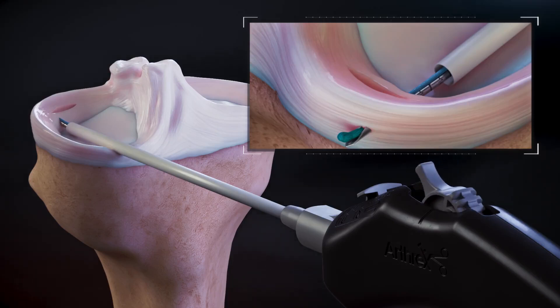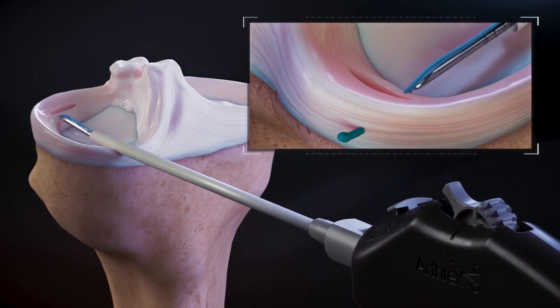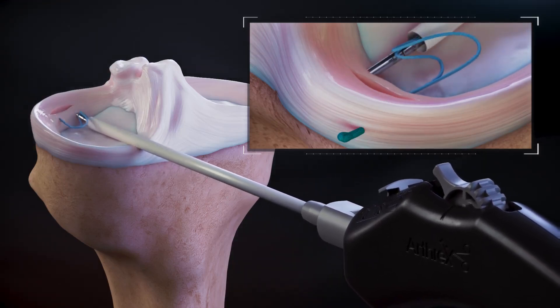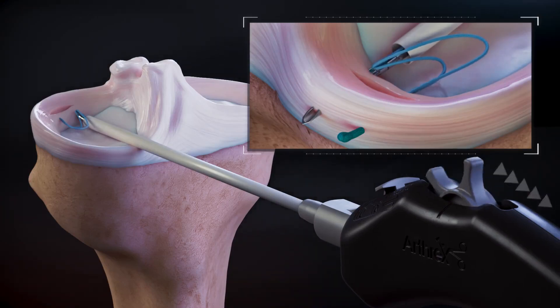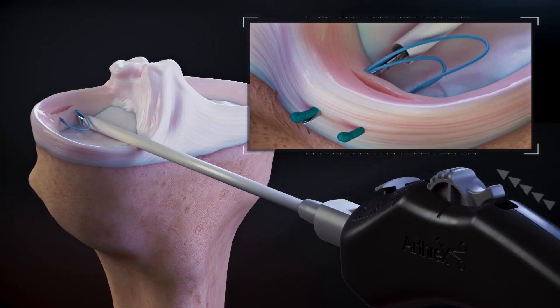Roll the deployment wheel forward to the hard stop to load the second implant. Advance the needle tip through the tissue in the desired location and roll the deployment wheel backwards to the hard stop. Roll the wheel forward to complete delivery of the second implant.